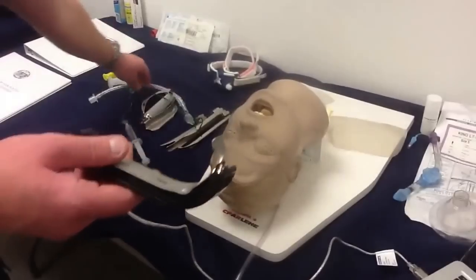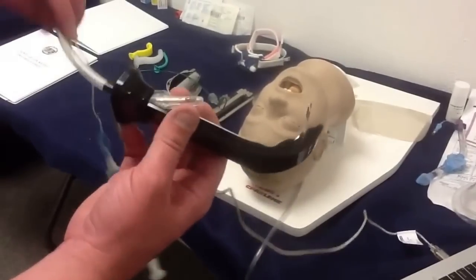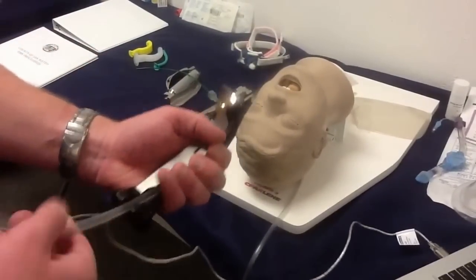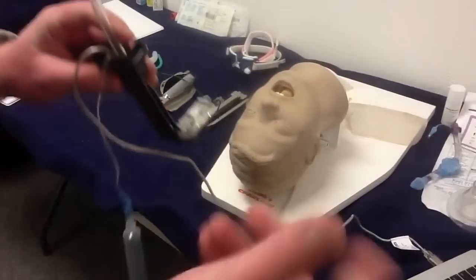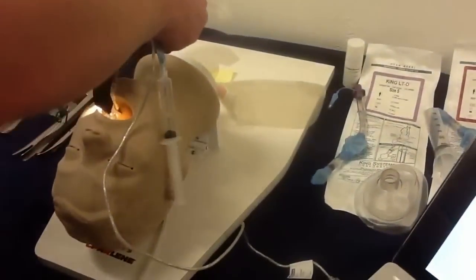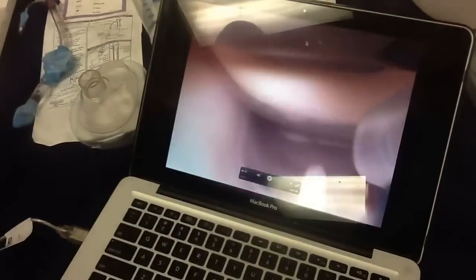What we're going to do is show you that it'll accept anything from a 6.5 to an 8.5 tube. Basically put the tube in, just like that — sits just like that. Now you're going to see over on the computer screen; you can come in and see on the monitor.